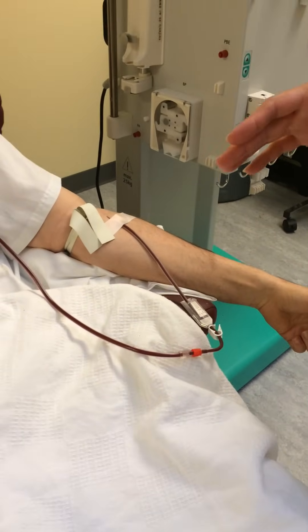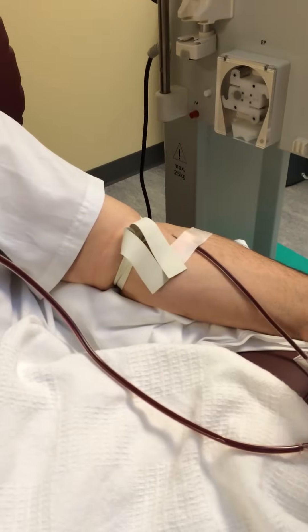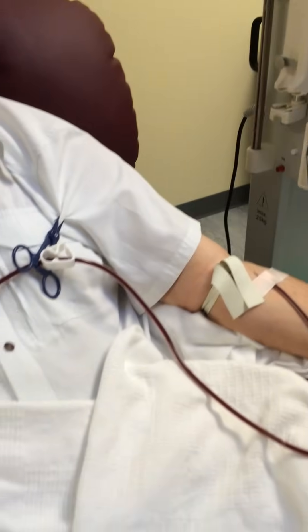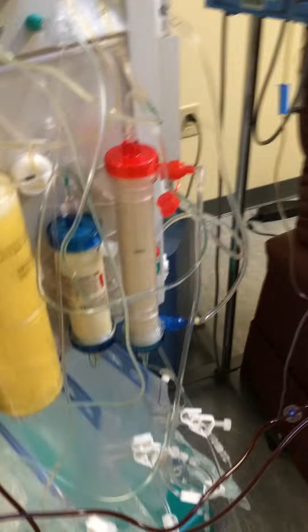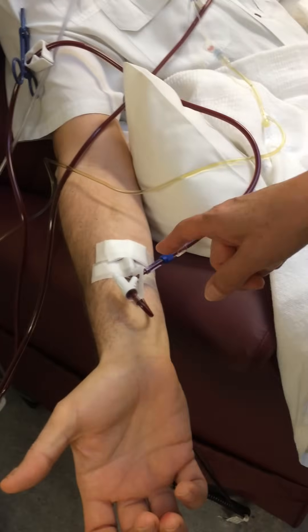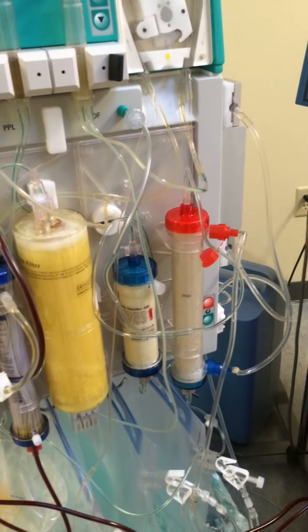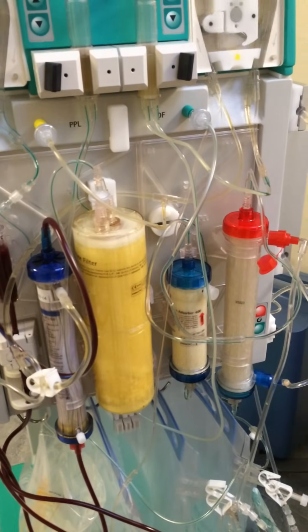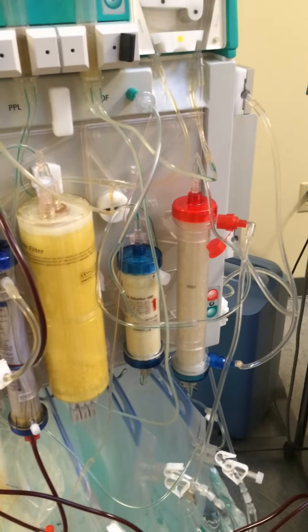This is the HELP LDL apheresis treatment. We start with a blood withdrawal site — we access one vein to withdraw blood from the patient to the machine, which is the B. Braun Futurera. We also need a return site so the blood returns to the patient continuously. There's no point of excessive volume depletion because it's an extracorporeal treatment where blood is continuously circulating out and back.